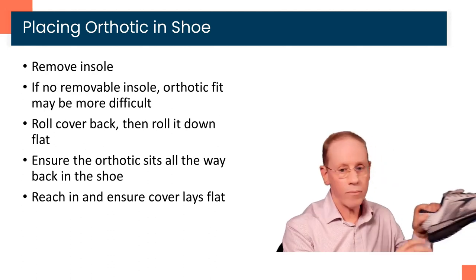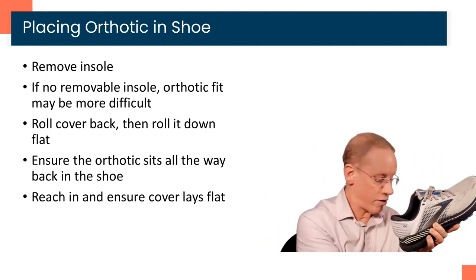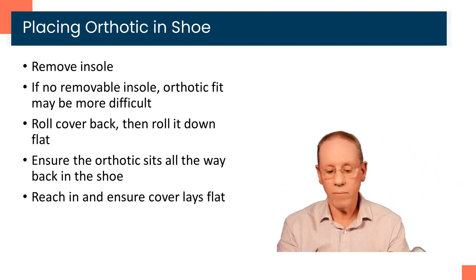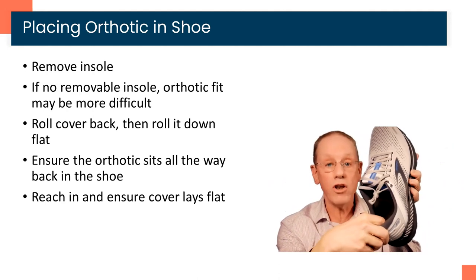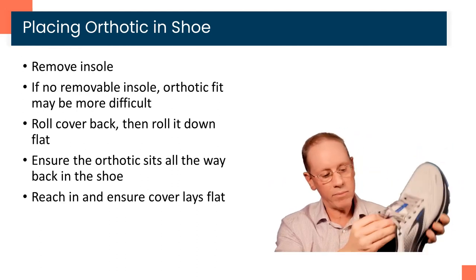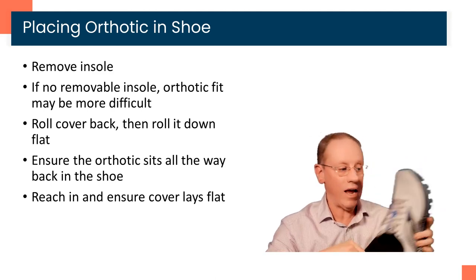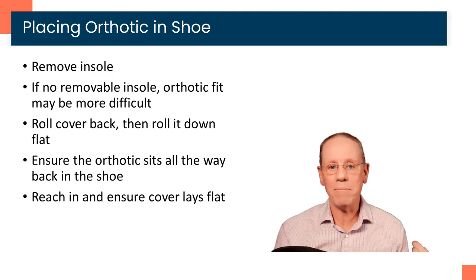When you place the orthotic in the shoe, the first thing you're going to do is take the insole out of the shoe. Then take your orthotic — and as I noted, sometimes this cover is unglued, so you're going to roll it back like this and hold it down with one finger. Then place it inside the shoe and push the orthotic back, making sure there's no gap at all between the back of the orthotic and the back of the shoe. Then simply roll that cover down, pulling the tongue up a little bit. Reach in and make sure that the cover is lying flat inside the shoe and not curled up on the ends.